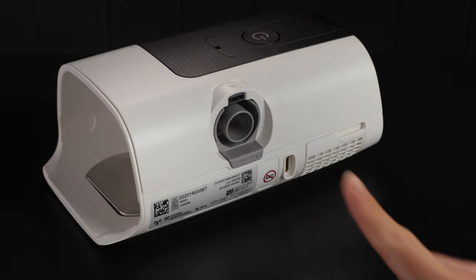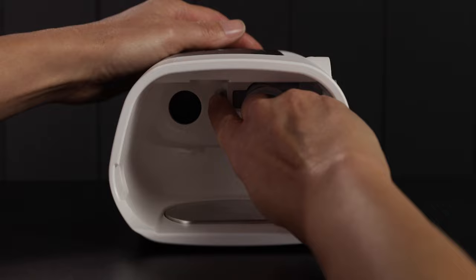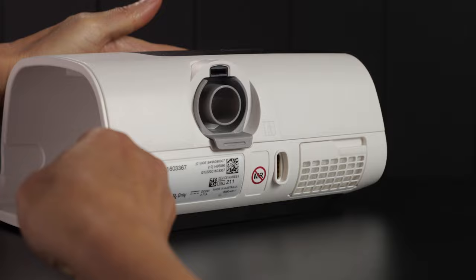Locate the outlet connector on the inside of the device and release it by pressing the clip firmly. Remove the outlet connector by pulling it out through the outlet connector socket at the rear of the device.